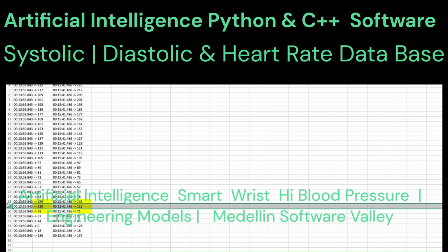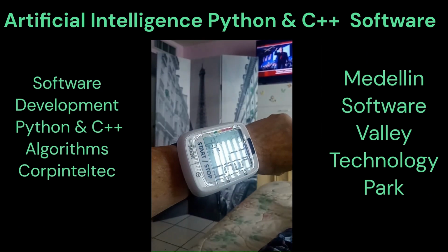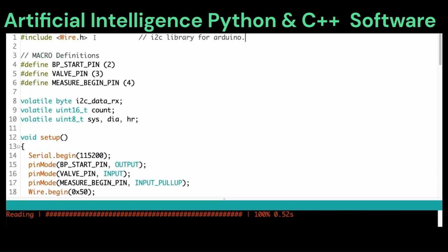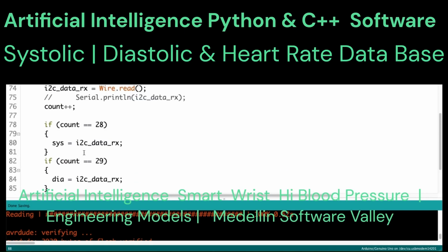So the ambulatory blood pressure data analysis model was applied to the blood pressure information collected through the ambulatory blood pressure measurement device to determine abnormality in the user's blood pressure.